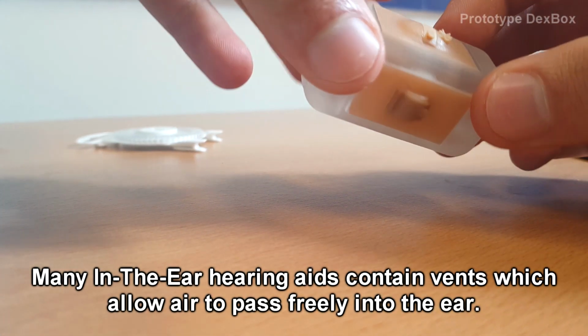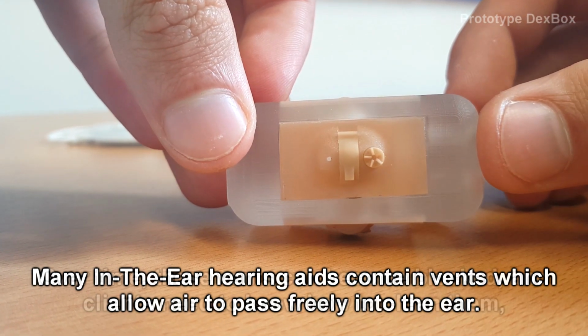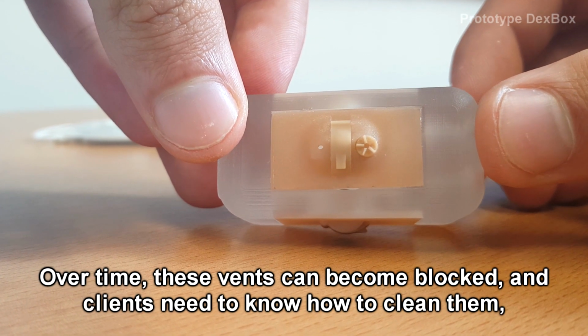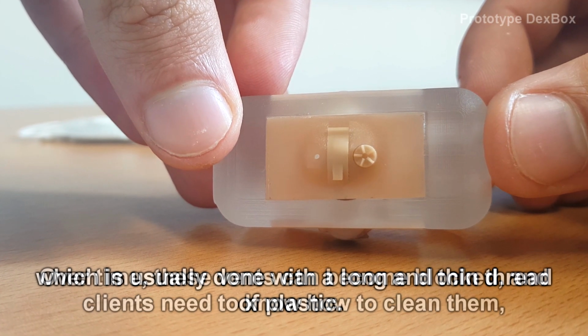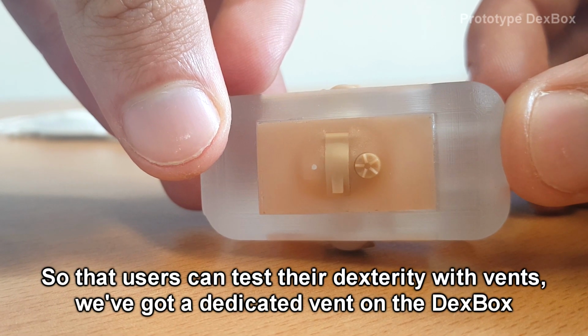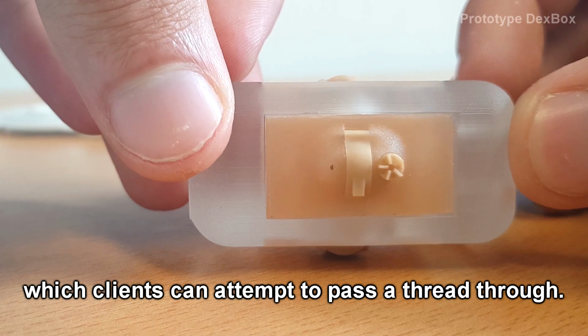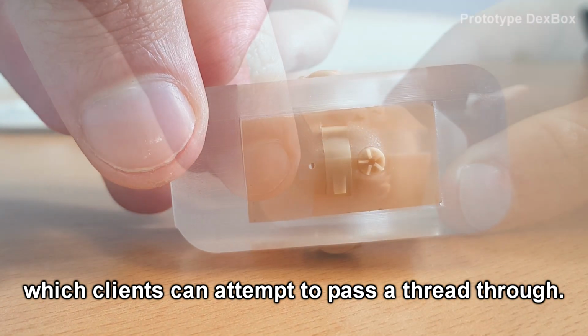Many in-the-ear hearing aids contain vents which allow air to pass freely into the ear. Over time, these vents can become blocked, and clients need to know how to clean them, which is usually done with a long and thin thread of plastic. So that users can test their dexterity with vents, we've got a dedicated vent on the DexBox which clients can attempt to pass a thread through.